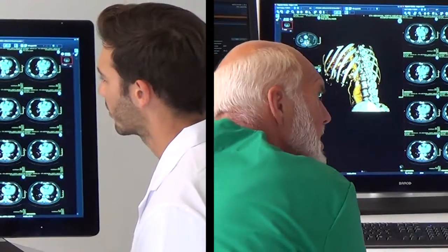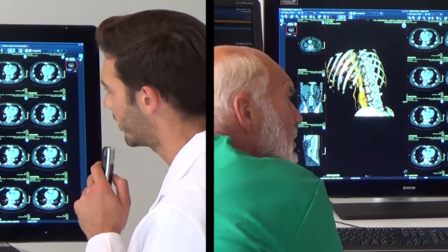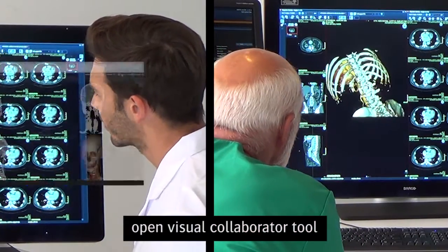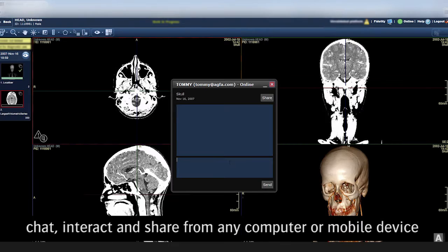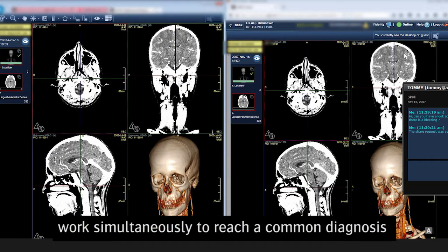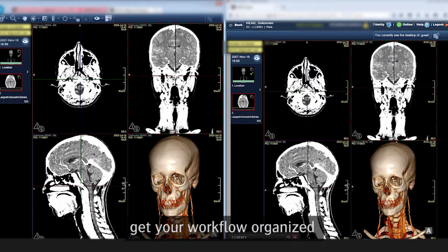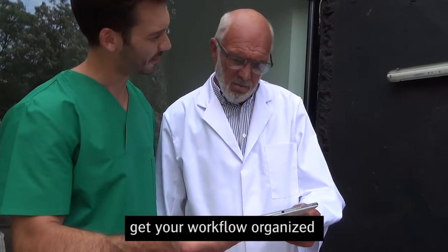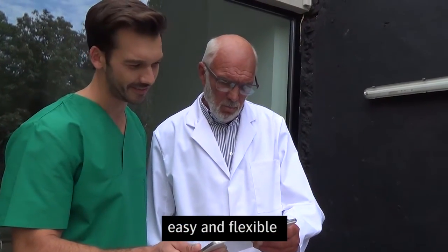Does a resident need ad hoc advice on a difficult case? No need to leave your own work. Simply open the visual collaborator tool and you can chat and interact, share the study from any computer or mobile device, and work simultaneously to reach a common diagnosis — all from wherever you are. You can get your own workflow organized while giving your residents guidance and feedback in an easy and flexible manner.